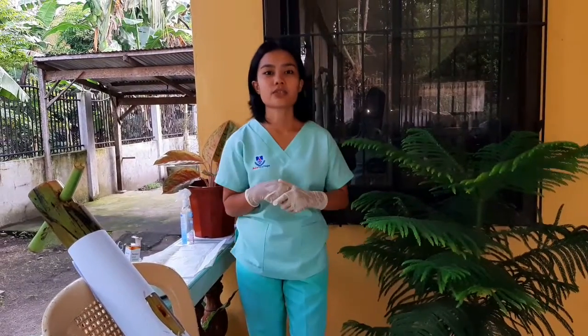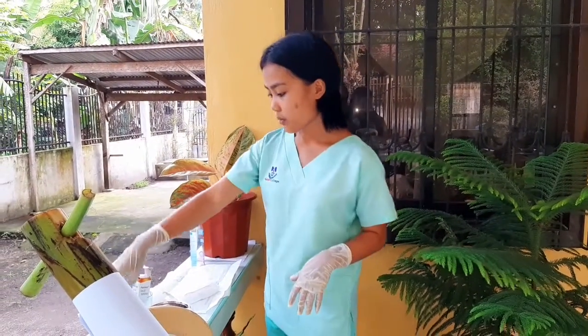Then apply antiseptic ointment if ordered. Apply sterile dry gauze, loosely woven, for the contact layer. Then I will be using a 4x4 gauze. So I have here a 4x4.